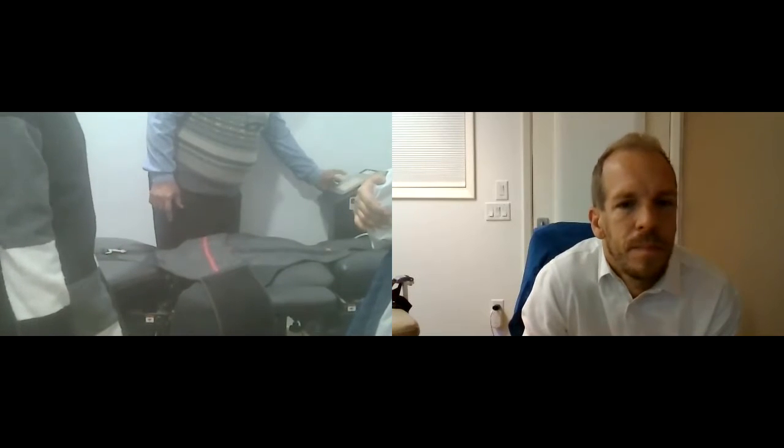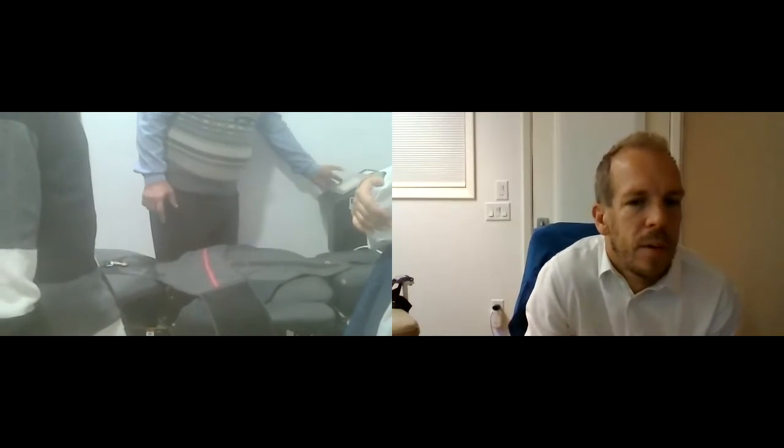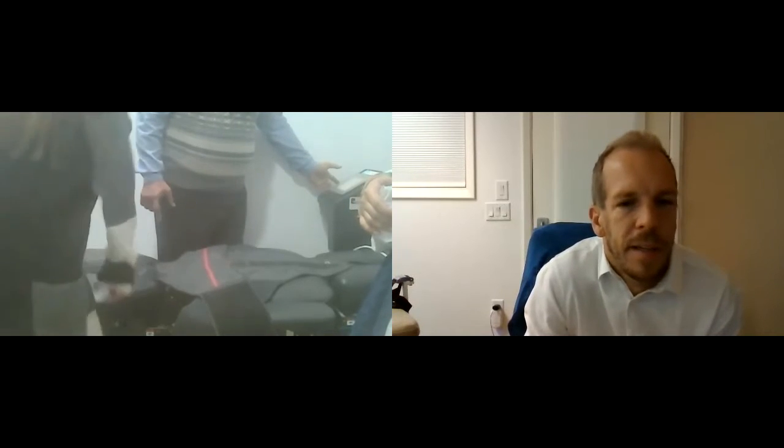It's going up. And then hold down the lower table. It's going down. This is for patients getting on and off the table, to get it to a comfortable height so that they can get on and off the table very safely.